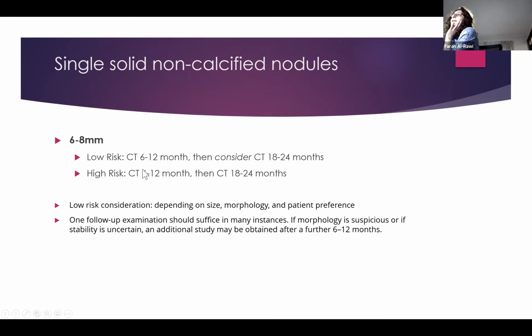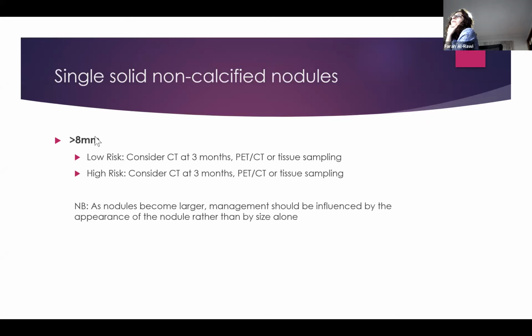the patient is worried, or has a family history, then we can just do a 12-month CT for reassurance. If it's a bit larger than that, again, we do the first CT at 6 to 12 months and then another in the following year, just to make sure it's not growing. For larger nodules, once it gets more than 8 millimeters, most of the time it's big enough to be seen on a PET. So if we do have the PET availability, then we can either do a CT at 3 months or further assess it with a PET scan, which basically assesses the metabolic activity of this nodule.